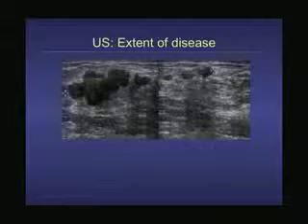But look what else we saw. There wasn't just that one. There was 2, 3, 4, 5. There were 4 little satellite lesions that were going along a ductal pattern that we couldn't appreciate either clinically by palpation or on the mammogram.